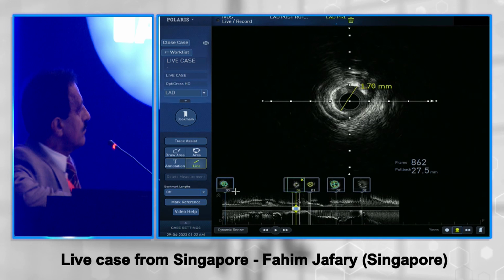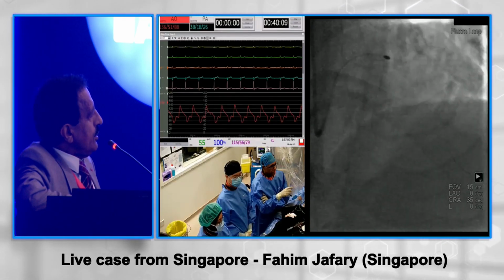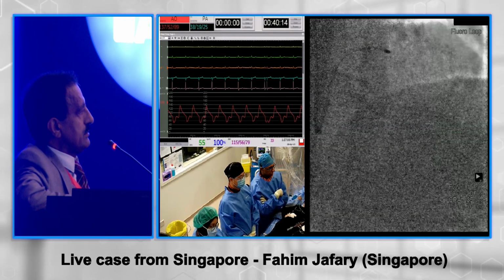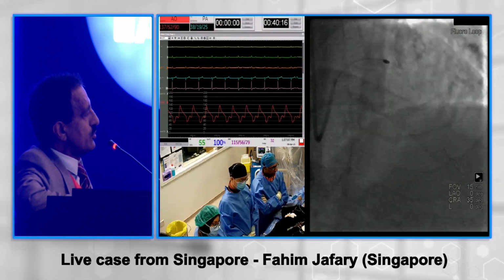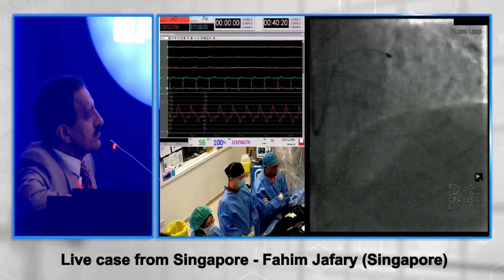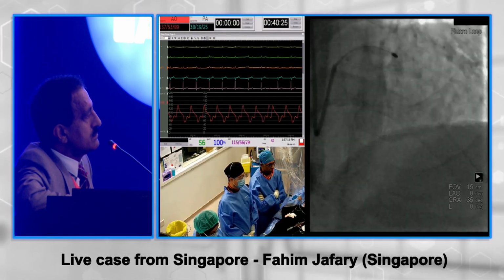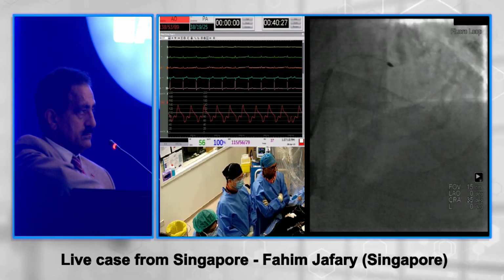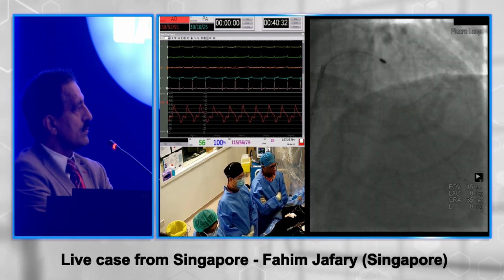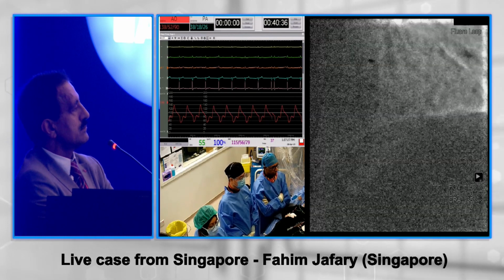So I'm going to ask Eric, can you see the screen now, the angiogram? So we went just forward. Fahim, you didn't consider any hemodynamic support in case of no reflow, or was there any concern about that? So upfront we put in a balloon pump. We would like to do Impella. The problem is the cost of Impella. Our concern was that some support is better than none, although the data with balloon pump is sort of iffy, but we felt that it would be helpful.